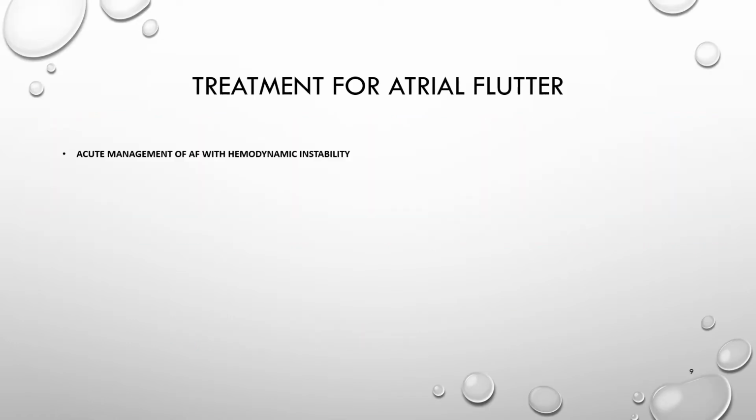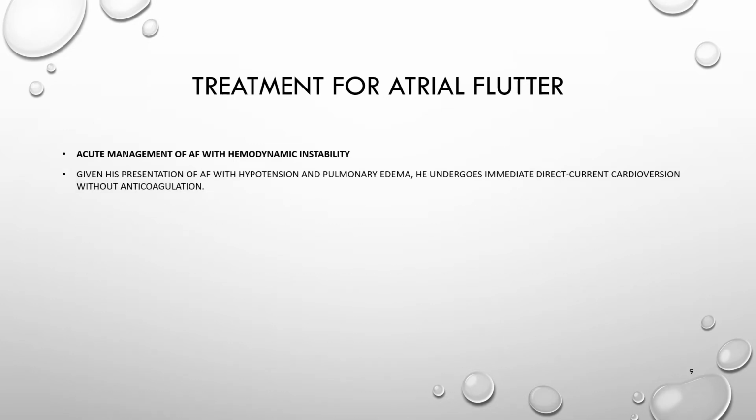Now that we identified that the patient's rhythm is atrial flutter, and we also agree that the patient is hemodynamically unstable, what would you do? Why would I say this patient is hemodynamically unstable? What made me think that is that the patient presented with hypotension and pulmonary edema.